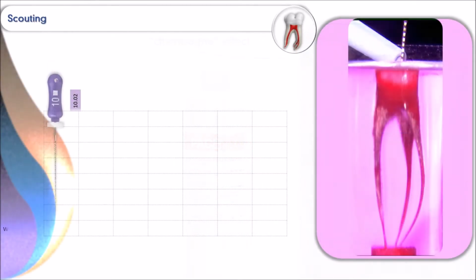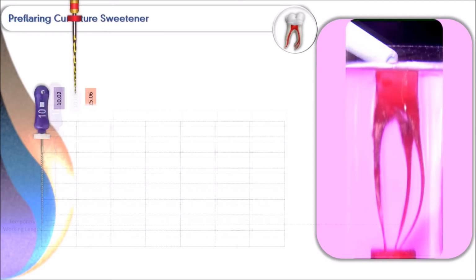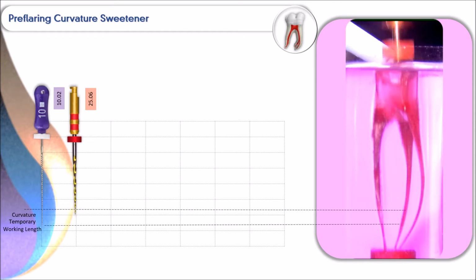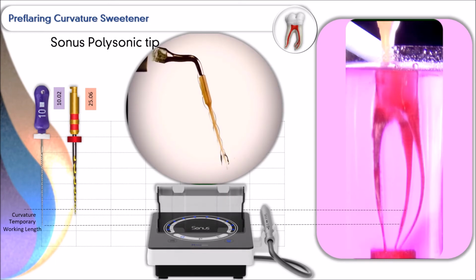We will start instrumentation using a number 10 stainless steel K file to scout the canal by inserting the instrument freely in an up and down movement, up to the temporary working length. Proceed with the 2506 curvature sweetener file, up to the middle of the curvature, or until finding resistance. Customized gold heat treatment and 19 mm length give this instrument the ability to partially enlarge the curvature entrance, leaving the area free of interferences to the next instrument in sequence. Copious irrigation must always be performed after 10 seconds of file usage.